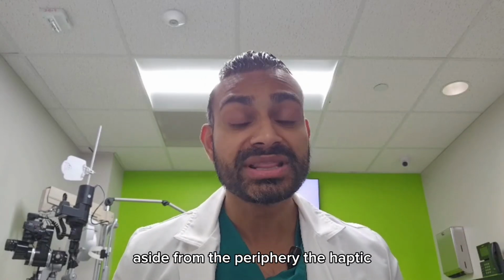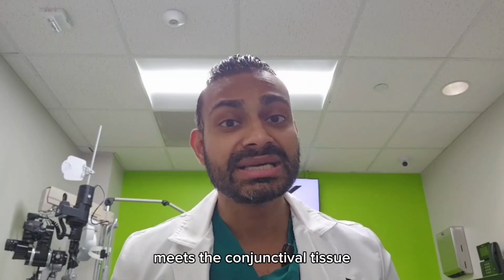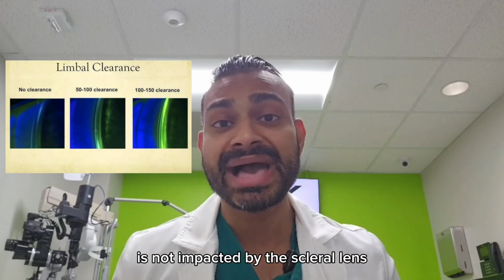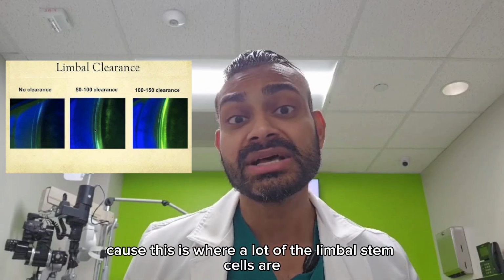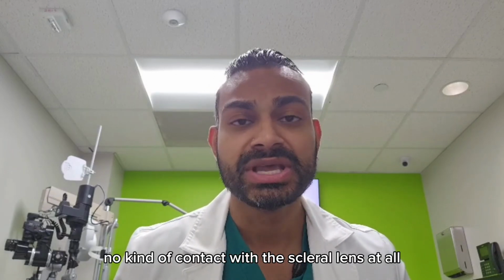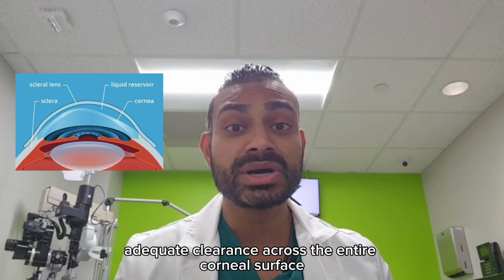Aside from the periphery, the haptic, we also come in a little bit closer to where the cornea meets the conjunctival tissue, this area called the limbus. This area is very important. We want to make sure that the area is not impacted by the scleral lens at all. It's vaulting over it because this is where a lot of the limbal stem cells are. So very important to keep the limbal area nice and healthy, no kind of contact with the scleral lens at all.